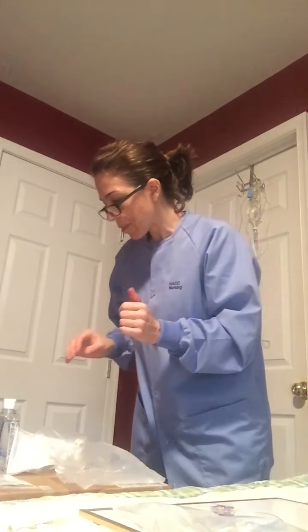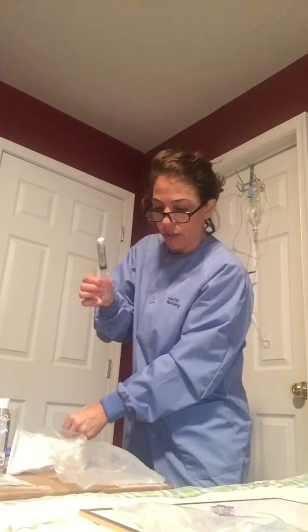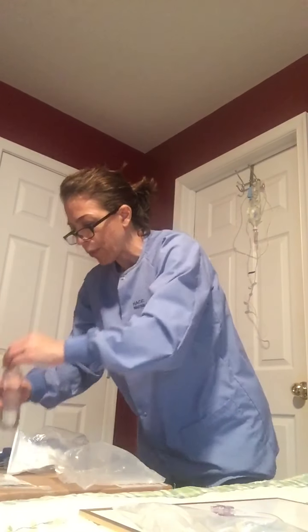So now I'm going to flush the extension tubing to check for patency, to make sure that the catheter is not blocked. I'm going to get my syringe ready, and if there's any air in this syringe, I want to invert it so that the air bubble is at the plunger. I'm going to perform hand hygiene again, and I'm going to put my gloves on.